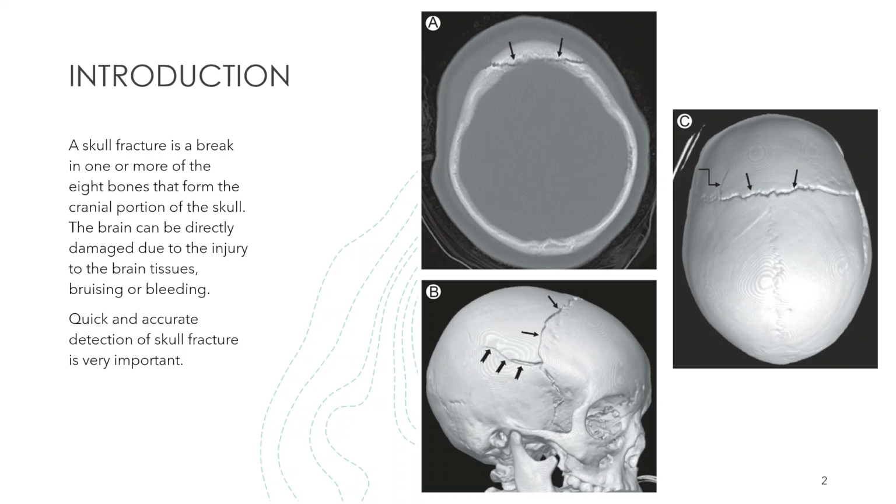Therefore, quick and accurate detection of skull fracture is very important. This project aims to develop an MIP-based method to detect and segment the skull fractures by using deep learning models.